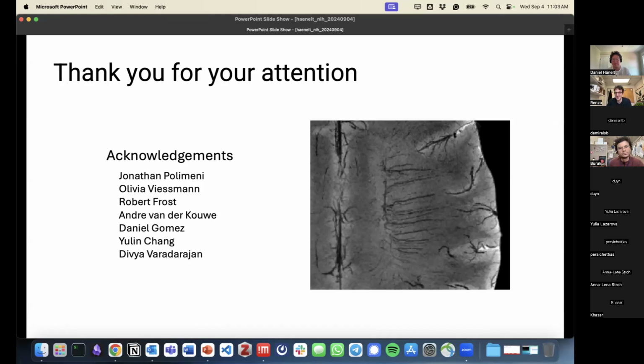And maybe this is not something you can do with respect to the real-time estimation of the motion parameters, but it should not be impossible to get rid of this little slab artifact in your navigator images, to just cut them out from the motion estimation. Or maybe you're doing that already. I'm not sure.